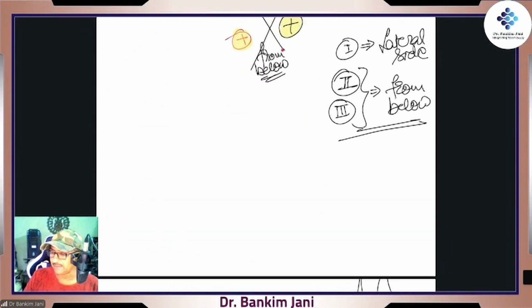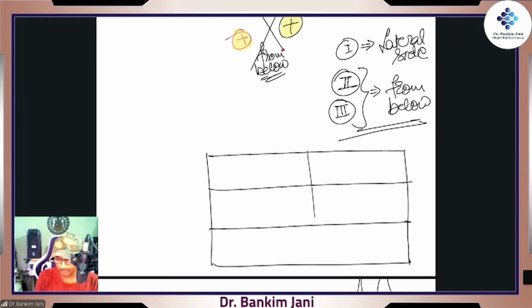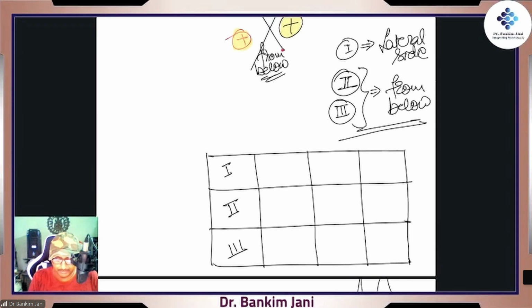That's how. And when we see the ECG, there is a pattern that we'll be getting like this. It will always be in this order: lead 1, lead 2, lead 3. Normally it is written lead 1, lead 2, lead 3, but when the ECG is taken in an emergency, then it is missed. So it is taken for granted that you know which lead is what, because it is always arranged in this order.